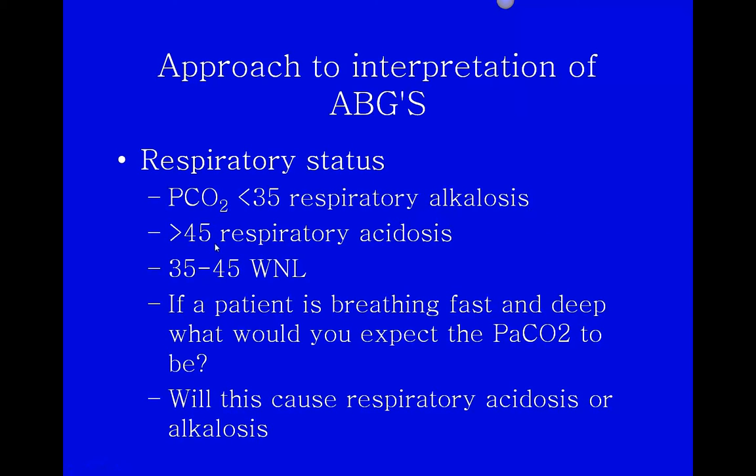Anytime the carbon dioxide is in a high range, it moves the body towards an acid pH. So carbon dioxide can move the pH up or down. Carbon dioxide in the body is considered an acid. If I save that acid, it's going to move the pH in an acid direction.